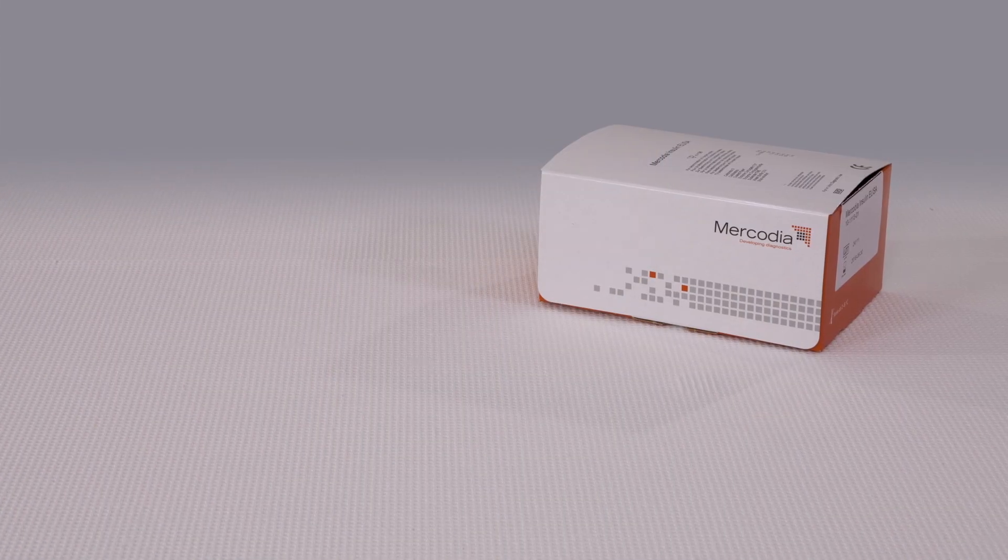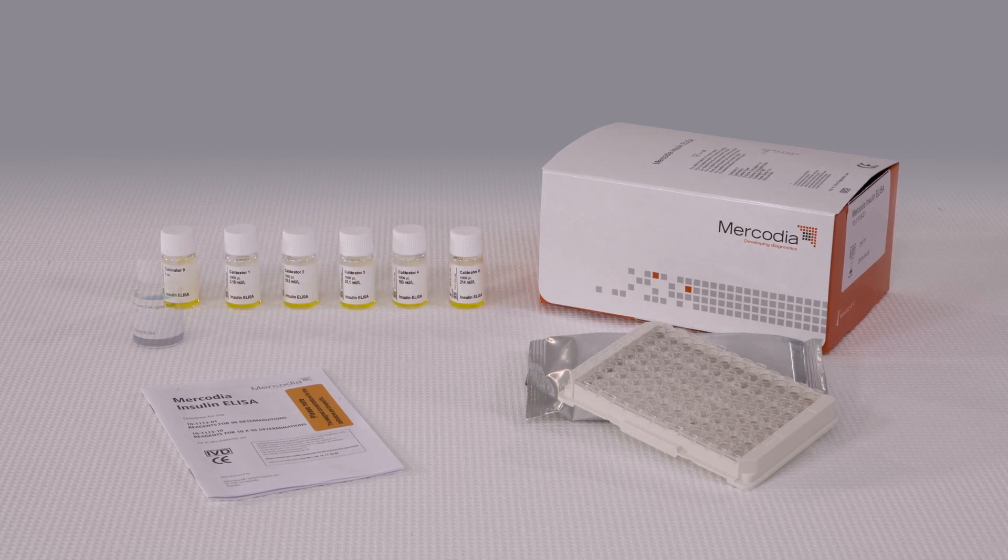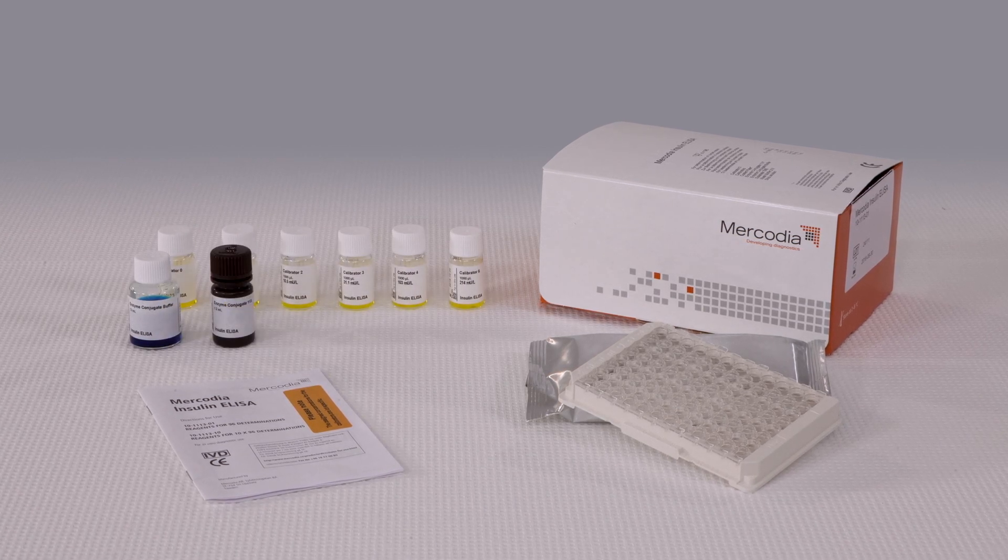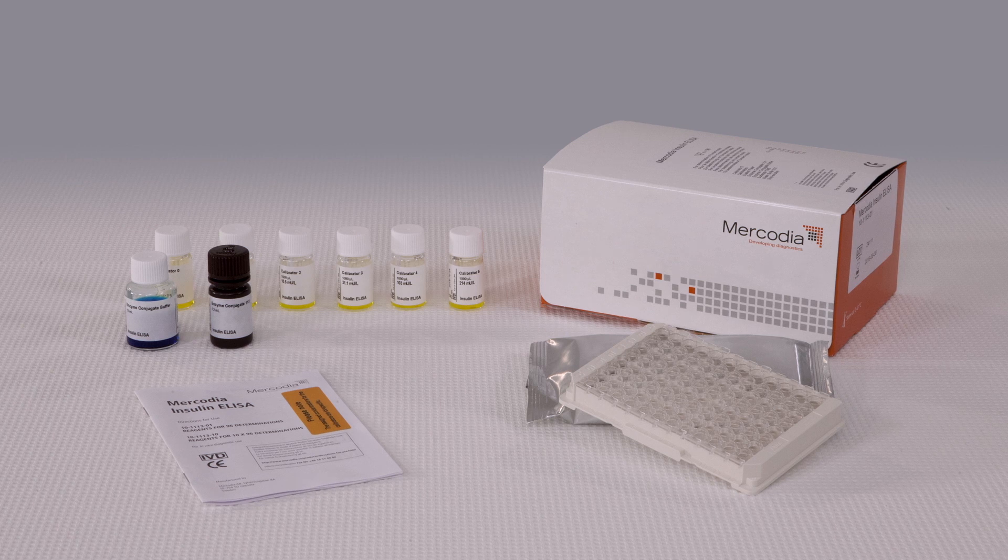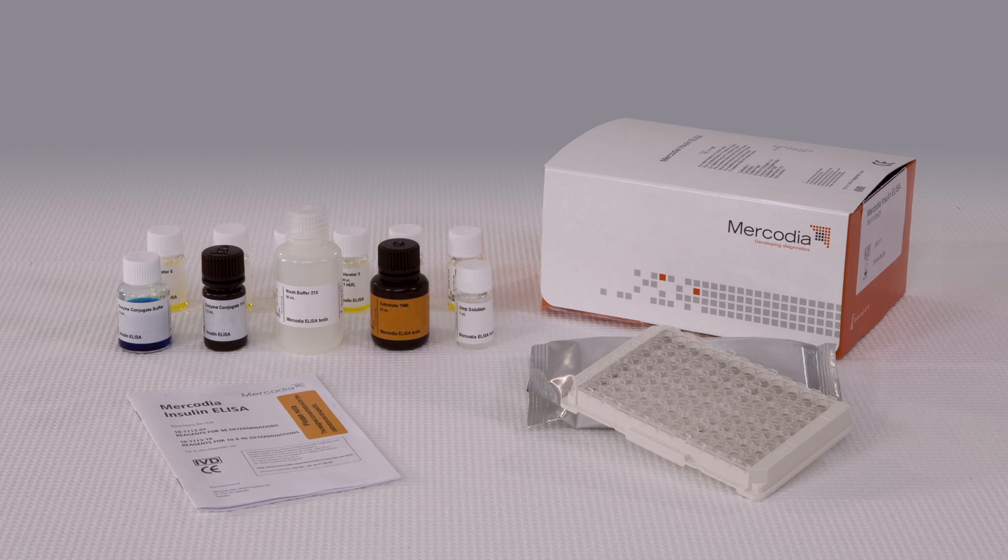In the ELISA box, you will find a 96 well-coated plate, calibrators, enzyme conjugate buffer, enzyme conjugate 11X, wash buffer 21X, substrate TMB, and stop solution.